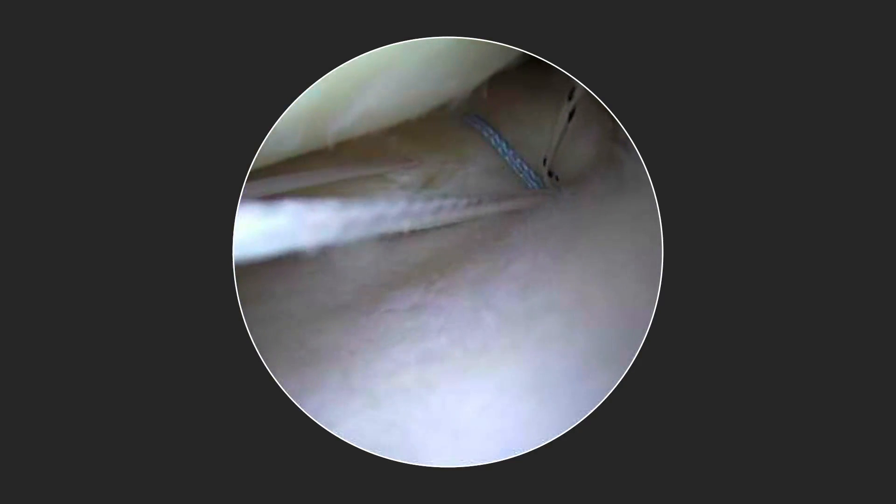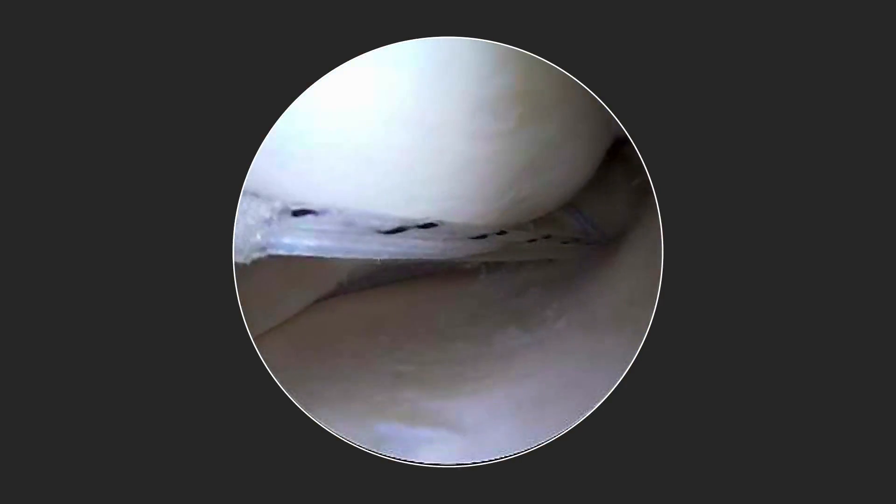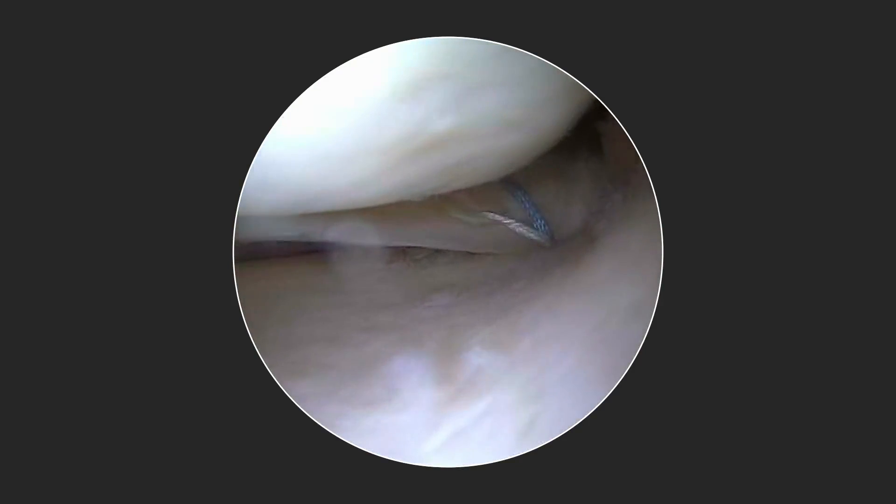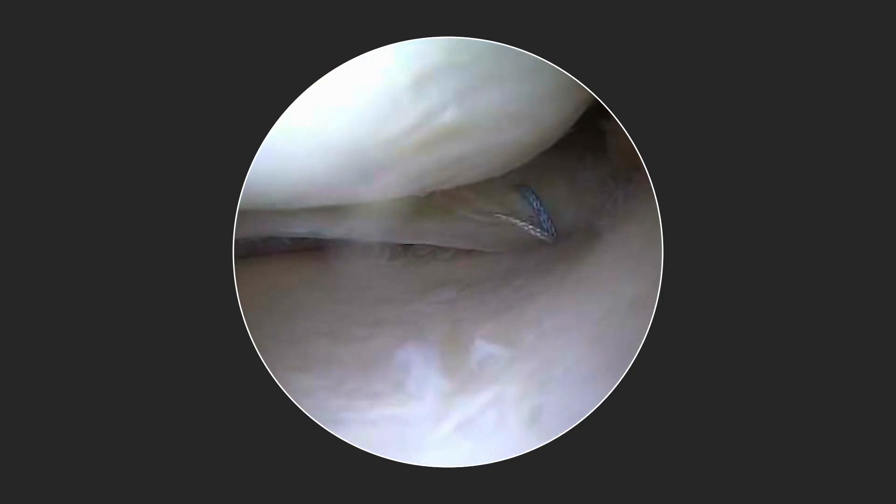We can then take our second repair suture and pass it in a very similar fashion. Once this repair suture is passed, it is shuttled down the implant utilizing our passing suture. Again, you can see how this very nicely tensions the meniscus in an anatomic position. Once our sutures are fully secured, you can see the ability to not only tension but also re-tension the implant to create an excellent anatomic meniscus root repair.